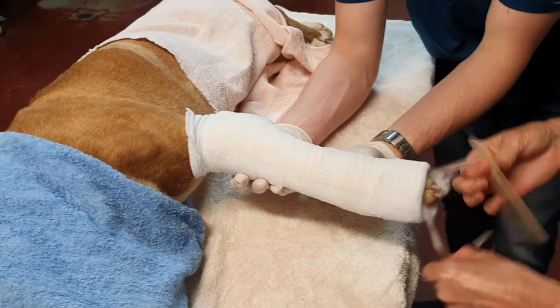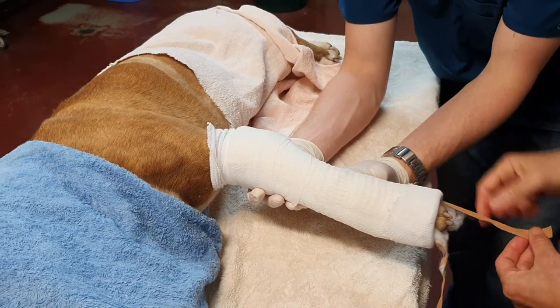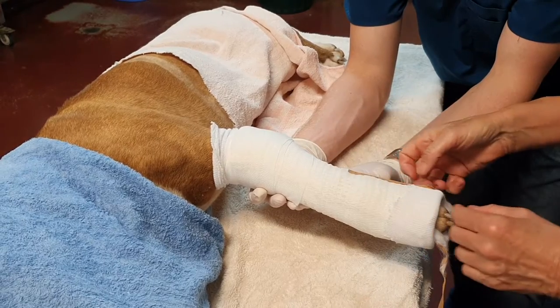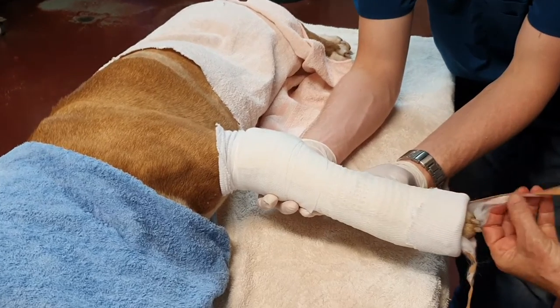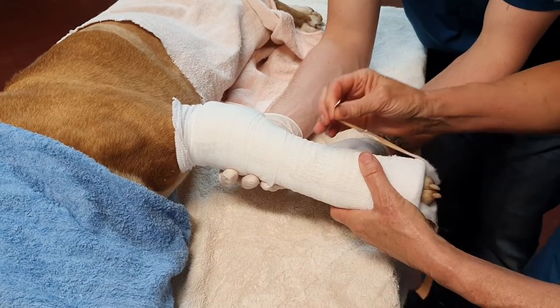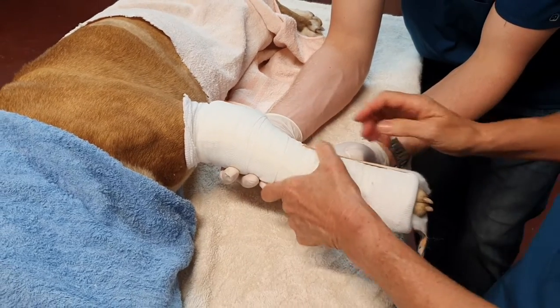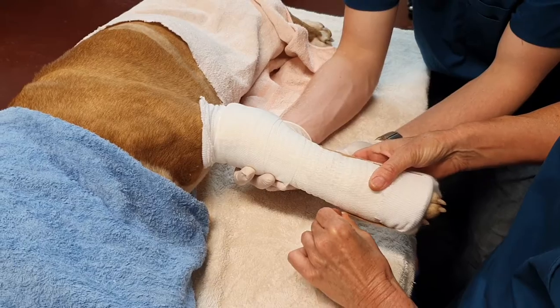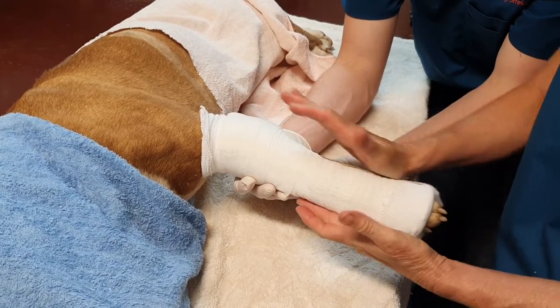Grab the stirrups. The purpose of the stirrups is to stop the splint slipping down. I have seen them just laid flat which is going to achieve nothing because they haven't got any pressure on the splint. So when you turn them over and bring them back up the cast — hoik up on it — you want them to hold this up the leg. Same on this side. I'm putting a fair bit of upward pressure on that to try and keep this splint uphill.